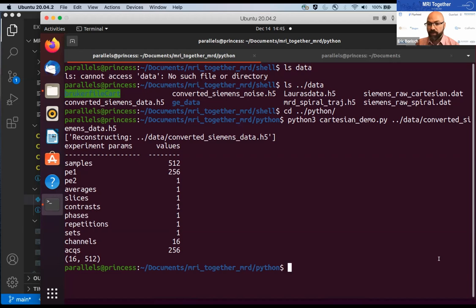Just reading off a question that came in chat real quick from Jacob Aslander, saying, thanks for a nice overview. Could you comment on the completeness of the header? I've so far been hesitant to use MRD as I do not want to store large data sets twice, and I'm worried that there is information in the Siemens header that I might need later, and I'm not sure if it is fully included in the MRD format.